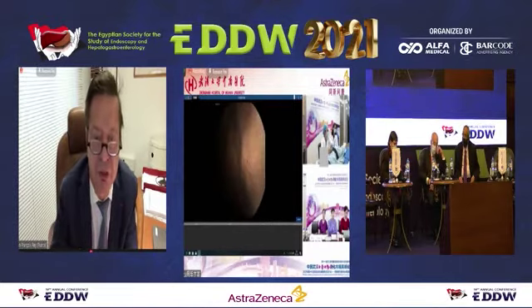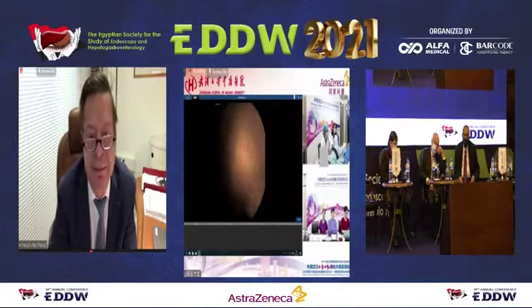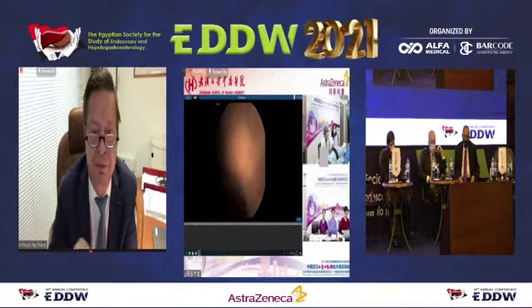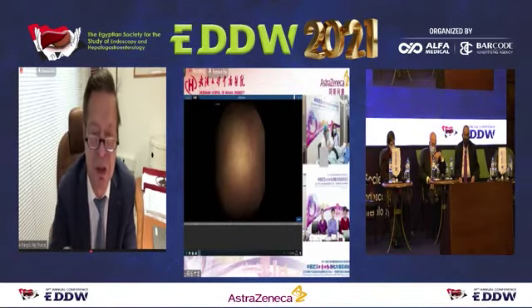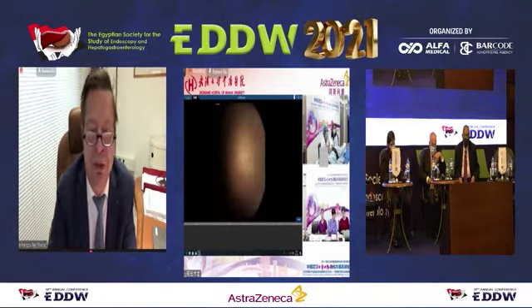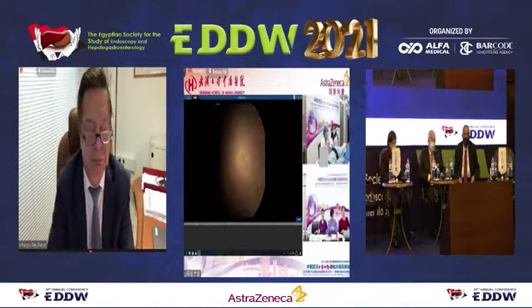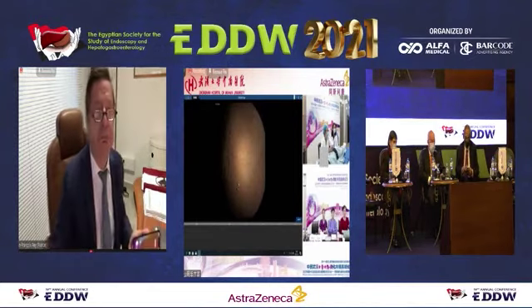When the capsule is next to the mucosa, we have the same resolution as the gastroscope. Not the latest generation gastroscope, but a routine gastroscope from 10 years ago. And Jensen are also developing a robot where all the gastric examinations are performed by a robot, but it's still under development.